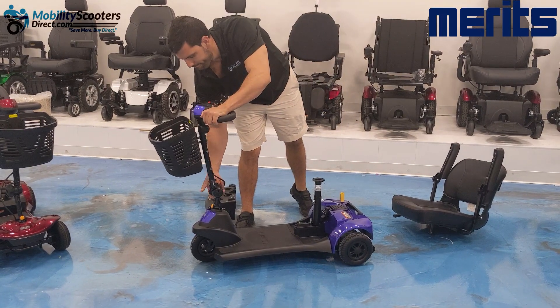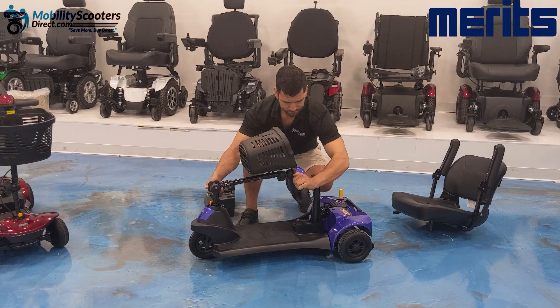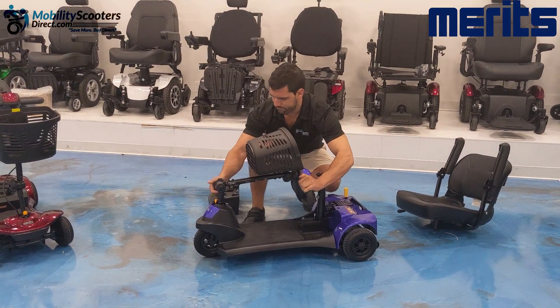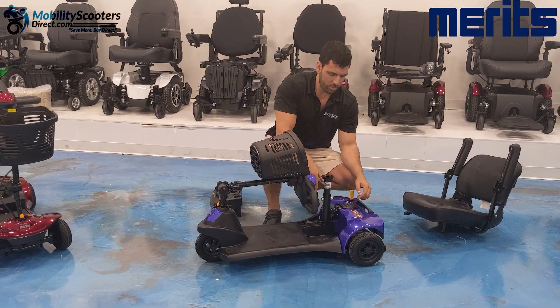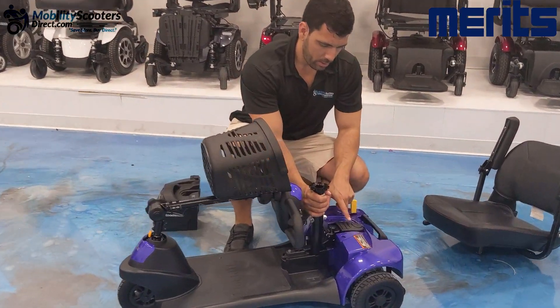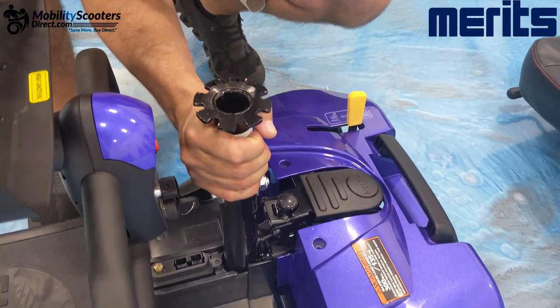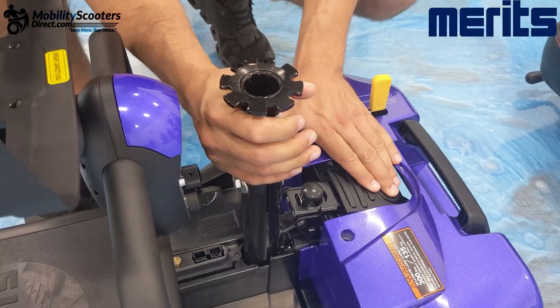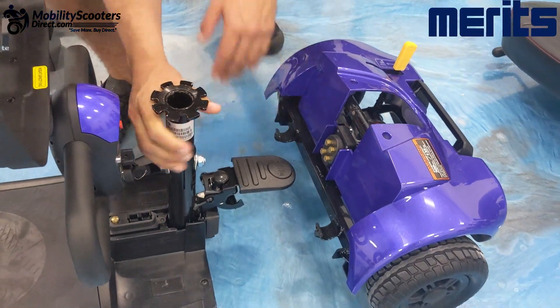To take the unit apart, it's very easy and we're going to demonstrate how. Lower the tiller all the way down and then look for the black tab right behind the seat post that the seat connects to. Press that down and then lift the seat post up and away from the rear — that will disconnect the unit.